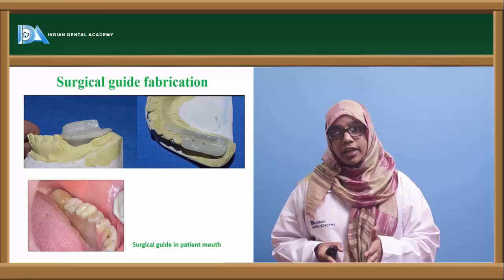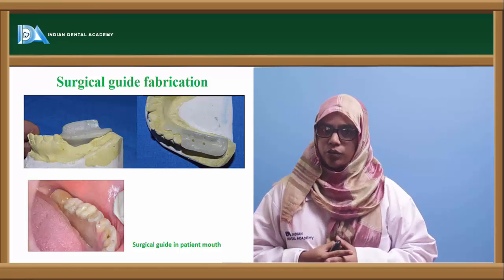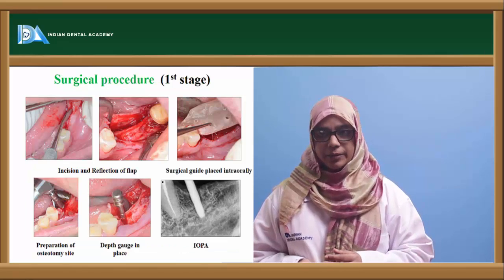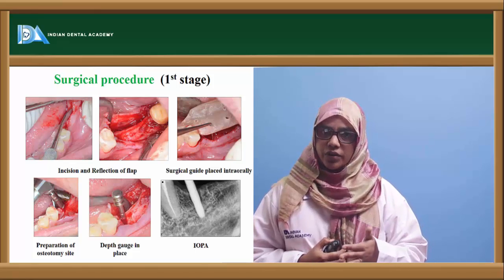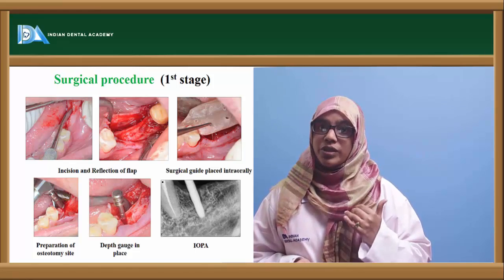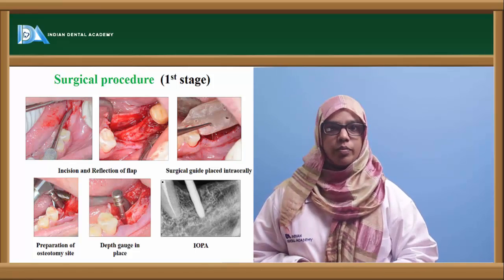Now the surgical guide will help you to place the implants parallel to each other and parallel to the adjacent teeth. It's very important. Once you have fabricated your surgical guide, you will start with your surgical procedure. You will give a crestal incision, reflect a mucoperiosteal flap, and see the bone. If there are any sharp edges, you will trim them. You will get sufficient width. Once you have done this, you put the surgical guide on and mark your purchase point.